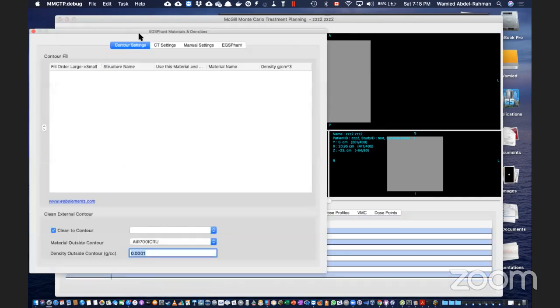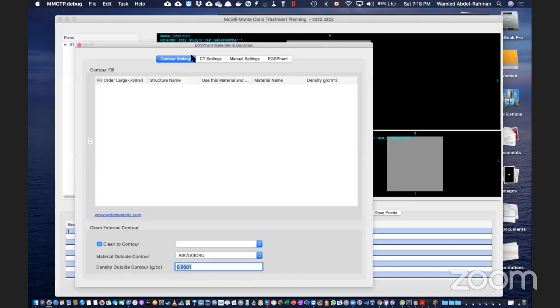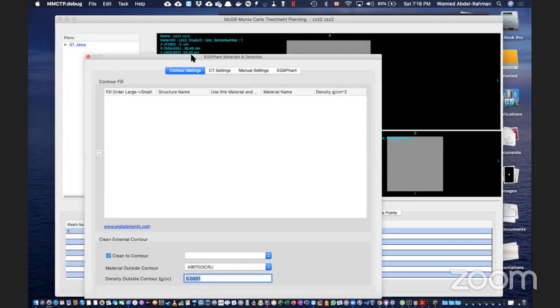The next step is we want to generate a phantom, the X phantom. So I click on that. This is the calculation voxels. We have image voxels and then calculation voxels. And since we don't have contours, I think this probably caused the bug. I had some issues when I created it. Everything is actually being replaced with air. And I think because there are no contours in the physics phantom, that might actually cause this. So we're going to see now.